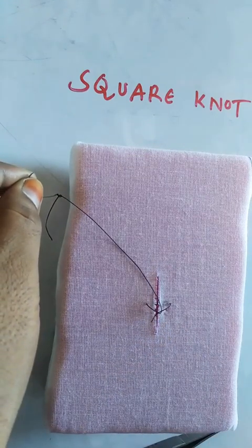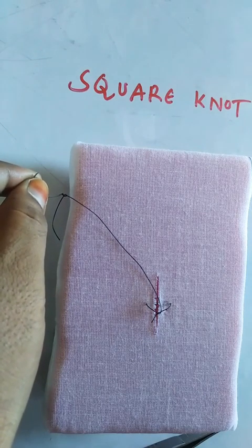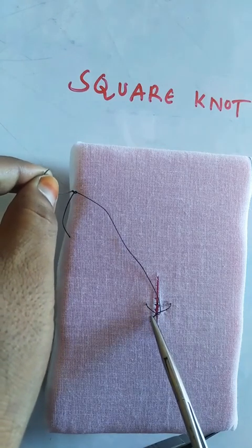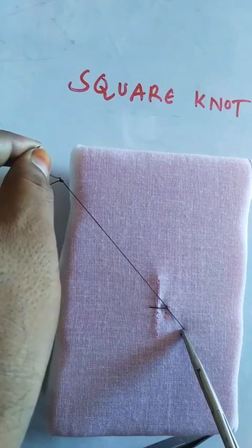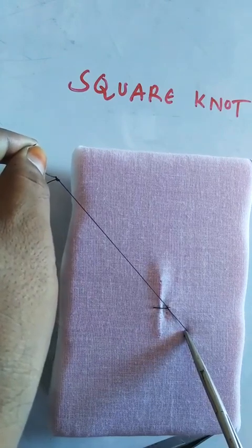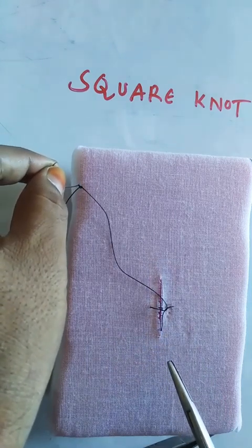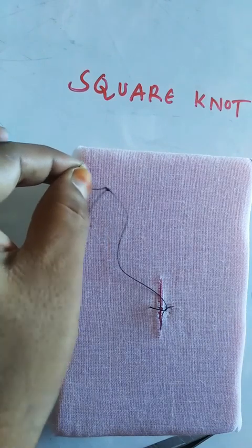You can see there is slippage of the knot. That is the disadvantage of the square knot. So someone has to hold when it slips to make the second tie. This is your first tie, and after that you make the second tie in anti-clockwise direction.